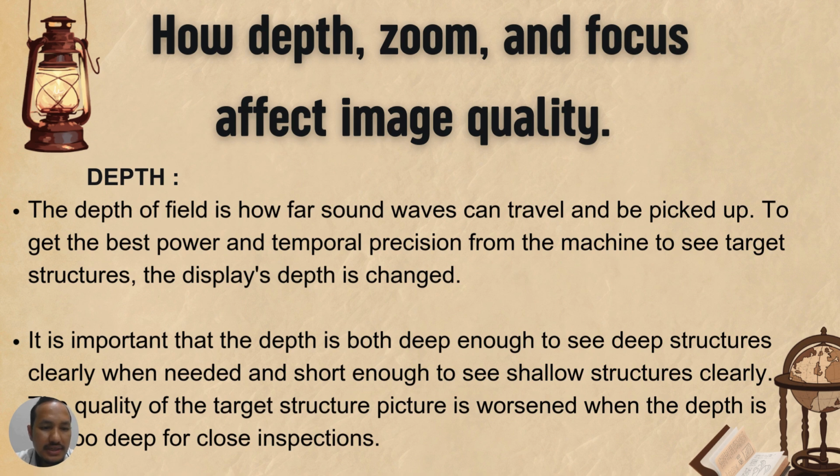It is important that the depth is both deep enough to see deep structures clearly when needed and short enough to see shallow structures clearly. The quality of the target structure's picture is worsened when the depth is set too deep for close inspection.